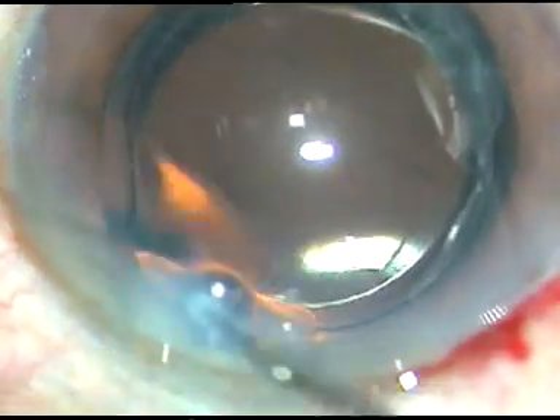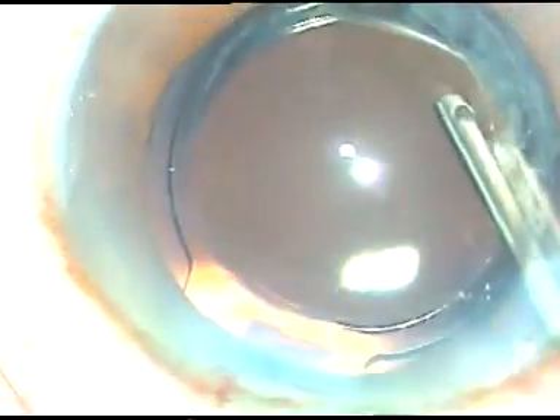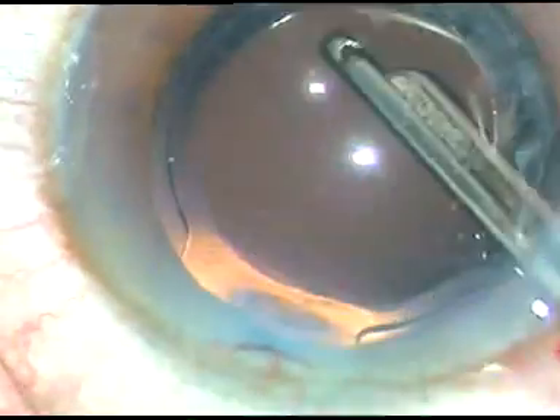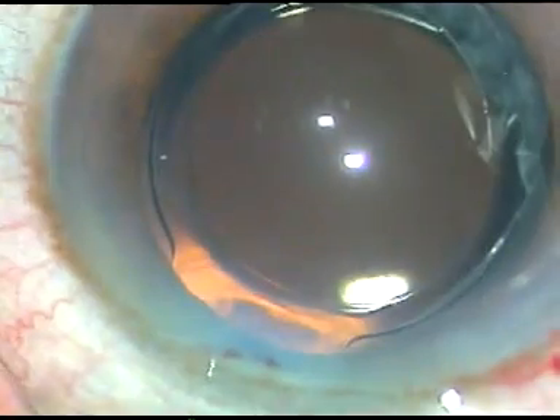This is BSS. Now I go to higher magnification to see the viscoelastic substance which sticks to the corneal endothelium come out. Here it is — you can see the viscoelastic which sticks to the corneal endothelium has come out. And now I come down to lower magnification for a thorough lavage of the anterior chamber, form the anterior chamber, and conclude the case.